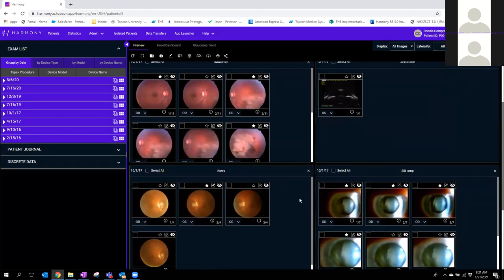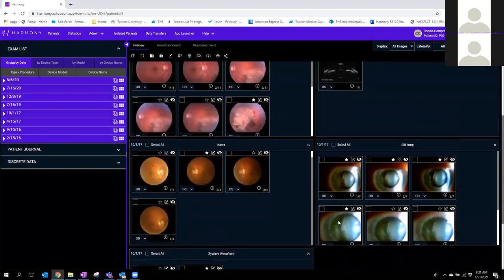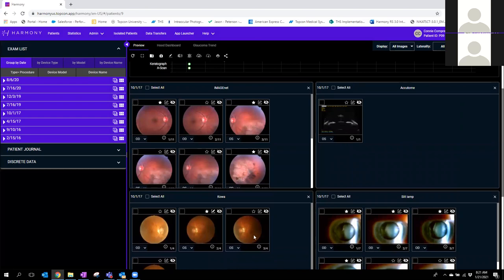Now getting into exams — how do we look at things up close? Let's jump to multiple side-by-side comparison. Single click anywhere on a thumbnail body to select it with a checkmark, click again to deselect. I'm going to select two fundus images. Once you have two checked off, I'll jump to the middle icon. It says 'compare' — if you don't know what an icon means, hover over it for two seconds to see the text. When I click on side-by-side comparison, I get a simultaneous view.